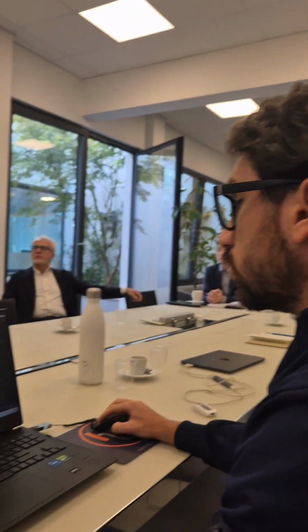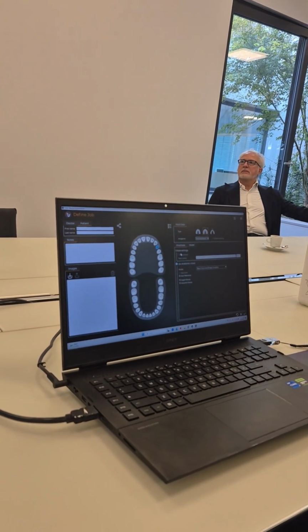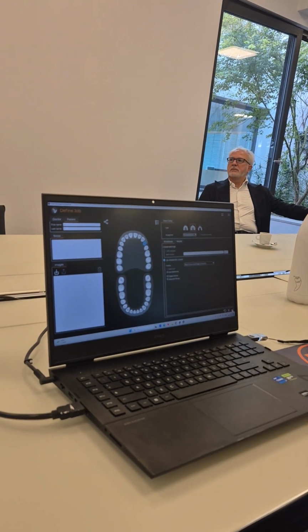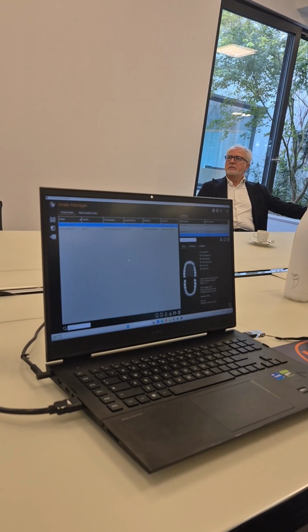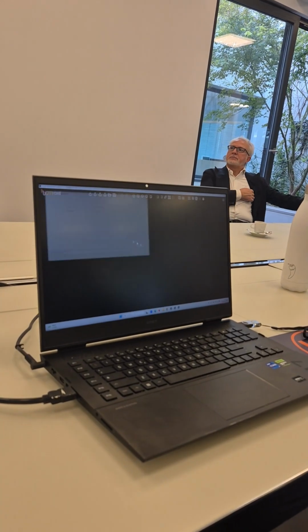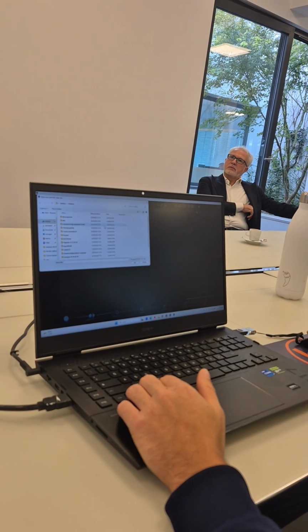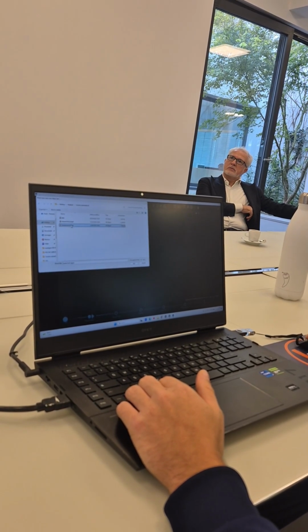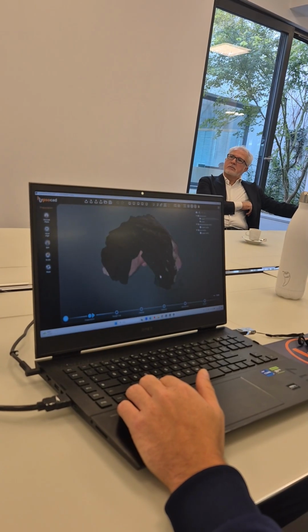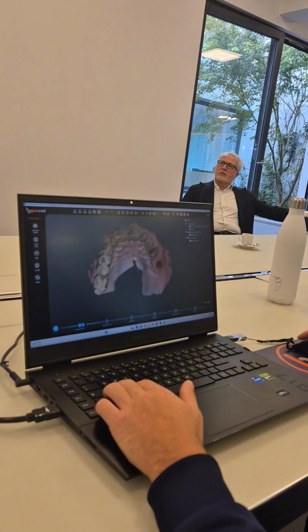In this case, we want to create a crown, so we need to write the correct defined job for the patients. Let's go on the CAD. We can import the STL file or the PLY file, like this. For example, in this case, we need to import the intraoral scan, and then we can model the crown, okay?